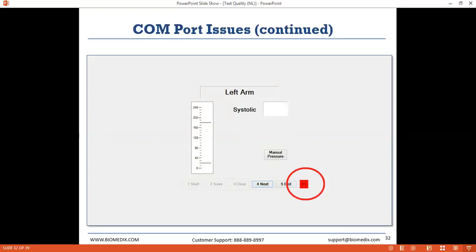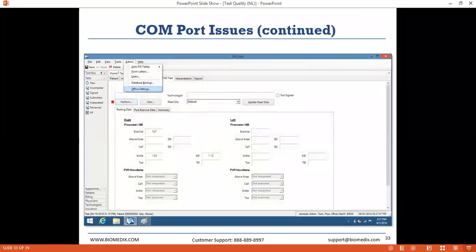close out the PADnet software and reopen it so that the software sees those renewed connections with the computer and you're ready to go. If you've checked all of those connection cables and everything seems to be turned on, everything seems to be plugged in securely, it's possible that the computer has simply, essentially forgotten where it's supposed to be receiving instructions from the device. Again, that's not uncommon because the device is plugged and unplugged all the time, moved from room to room. Sometimes office technicians plug in their phones to recharge from the computer, things of that nature.